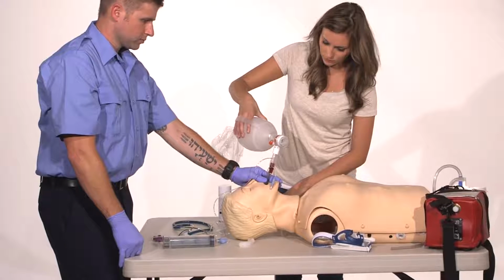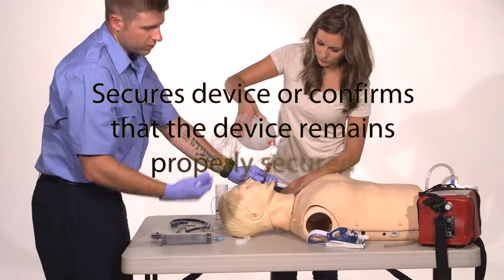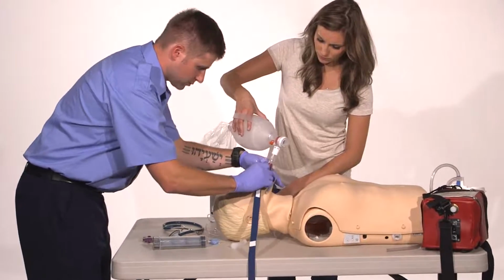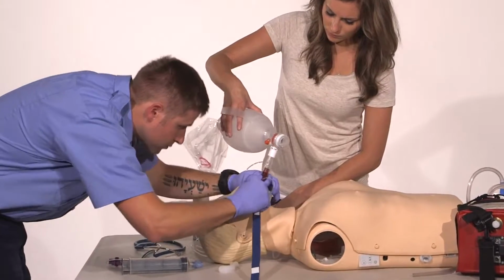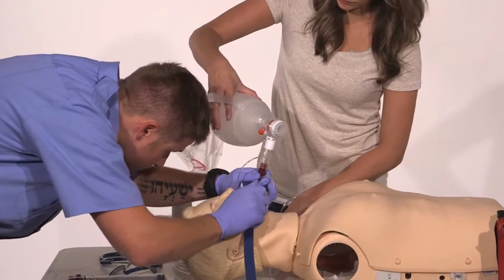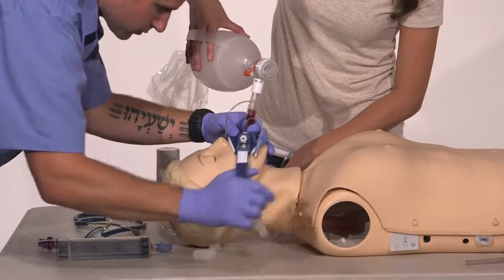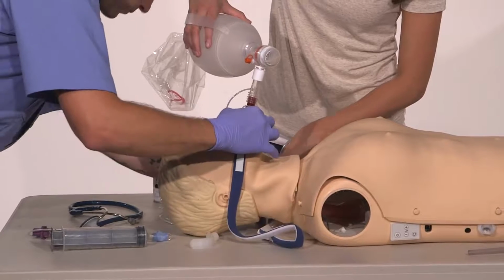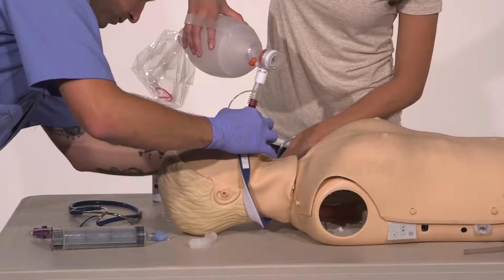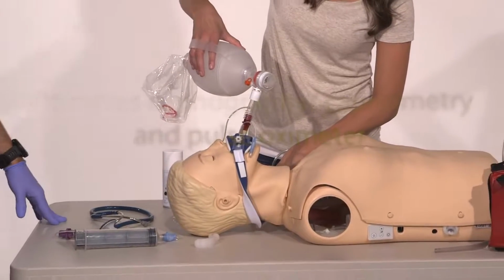How would you know if you are delivering appropriate volumes with each ventilation? Equal bilateral chest rise and fall. And at this time, I'll secure my device. Device is secured and continuing ventilations at 10 to 12 breaths per minute.